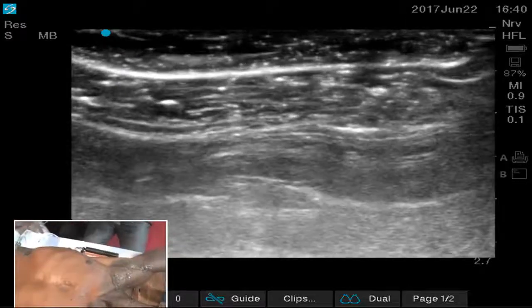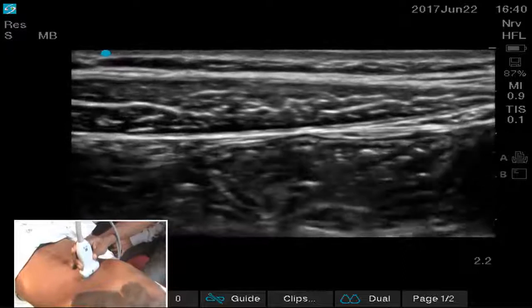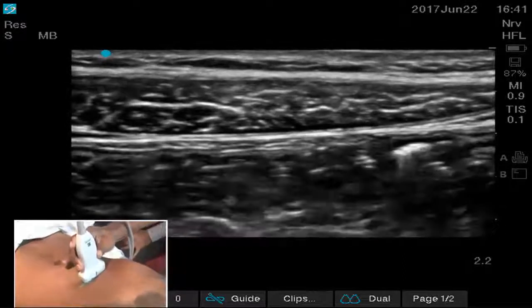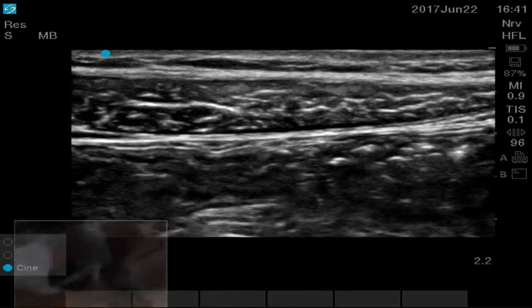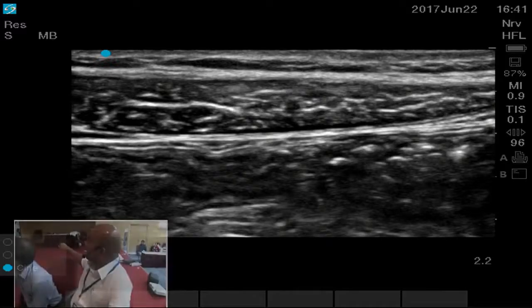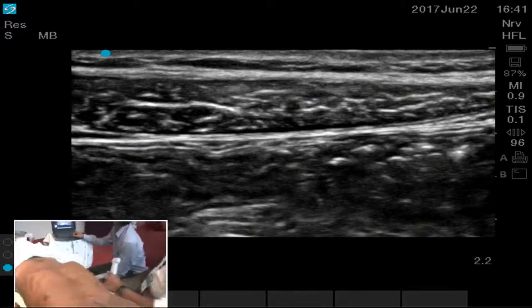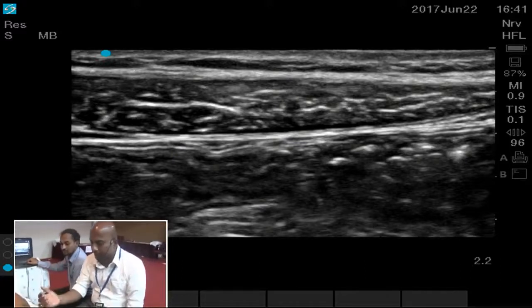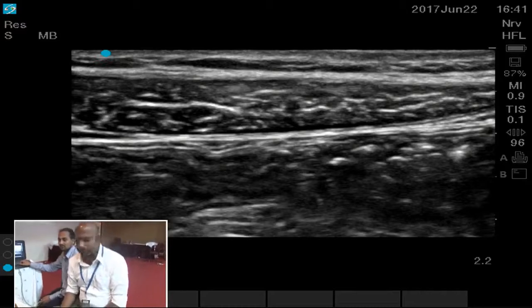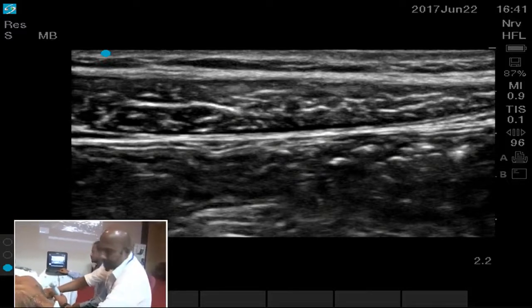So now coming to the abdomen, the center is the linea alba, and then when I come just lateral, you can see the rectus muscle. Freeze it. So now, this is the posterior rectus sheath. Here there are actually two layers that you are seeing. The first white line is the rectus sheath. If you separate the rectus muscle from the rectus sheath, that is called a rectus sheath block. So for T6 to T10, for upper abdominal incisions, you have to do the rectus sheath block. And then for T10, from umbilicus to below T12, we will do a classical TAP.